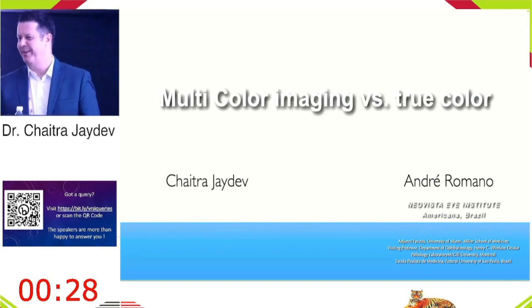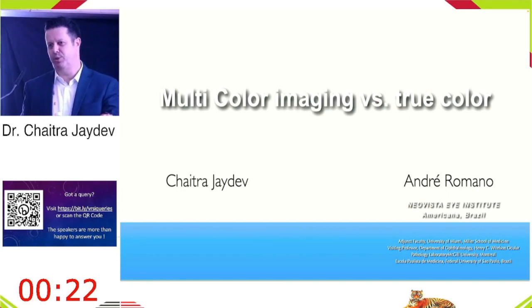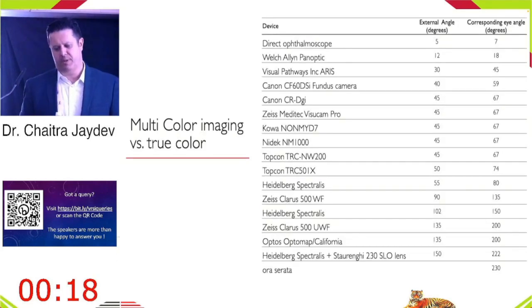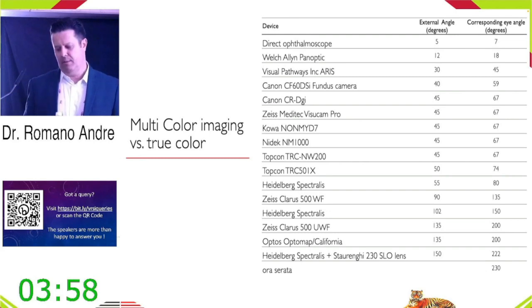So we'll have to agree. I'm a big fan of multicolor imaging. We do photograph some patients with true color, and there are several machines today, including the Mirante as well, that offer it. But you can see the difference between the angles and the corresponding eye angle of these patients.